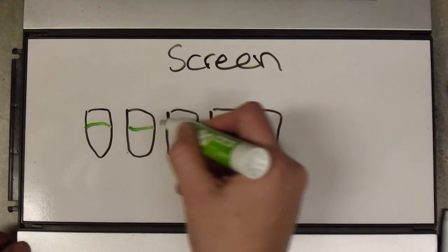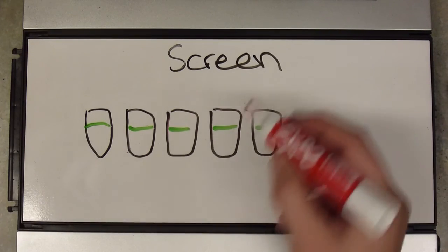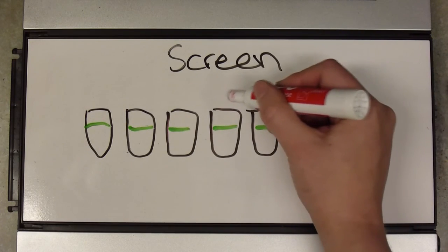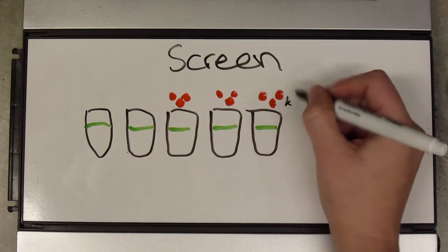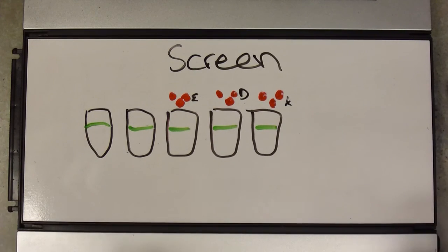So we take the patient's serum, put it in a whole series of test tubes, and then we add donor red blood cells that have a known antigen on their surface. There's all kinds of red blood cell antigens other than the major blood groups. There's Kell, there's Duffy, there's little symbols for all different sorts.